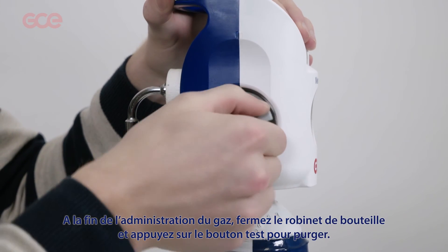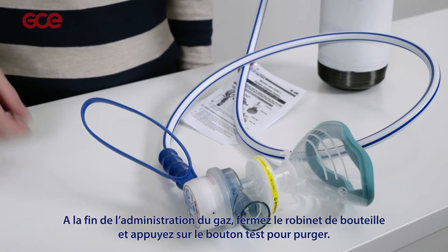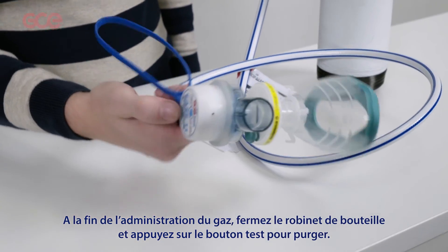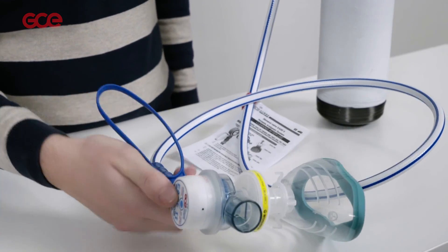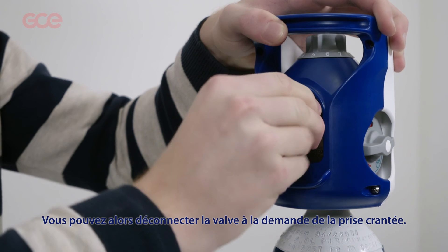When the administration of gas has been completed, close the cylinder valve and push the test button to depressurise. You can now disconnect the demand valve from the quick connector.